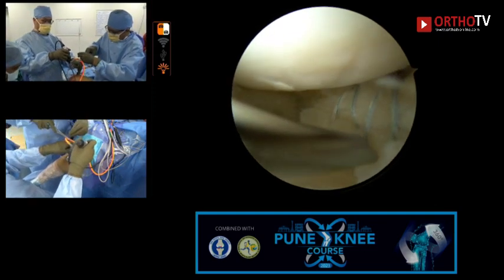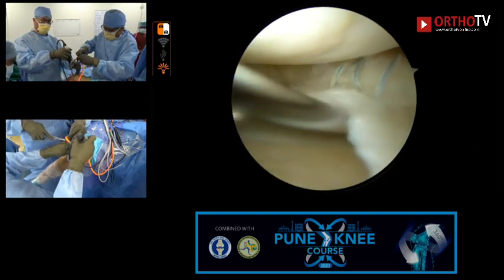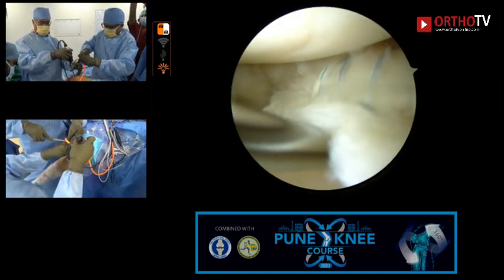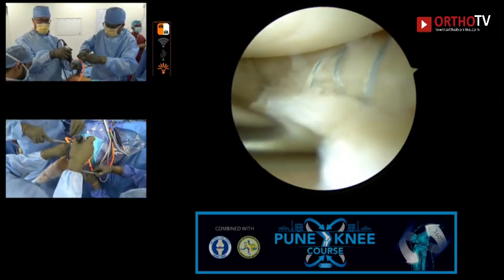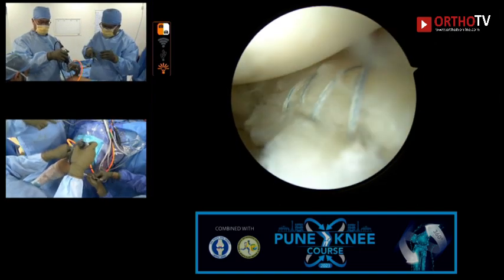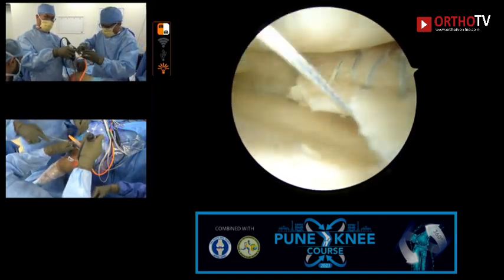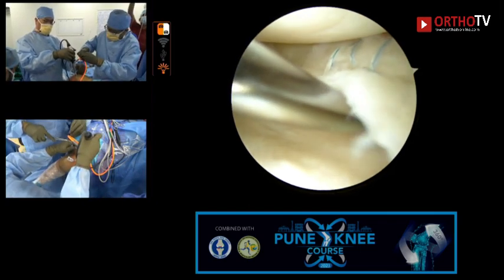So I'm just choosing the bent cannula to put in the inferior suture because I cannot see it. Yeah. So one of the great things with the in-to-out suturing, as Dave's showing us, is you can choose a curvature of cannula to reach the desired portion of meniscus. And, you know, people talk about out-to-in suturing for the anterior third of the meniscus, but if you bend the cannula, you can use an in-to-out, I think, for the whole way round the meniscus. And I nowadays almost only use in-to-out sutures, even right by the roots of both menisci.